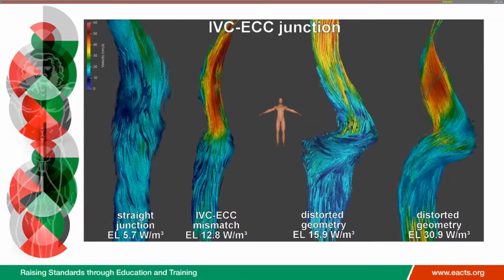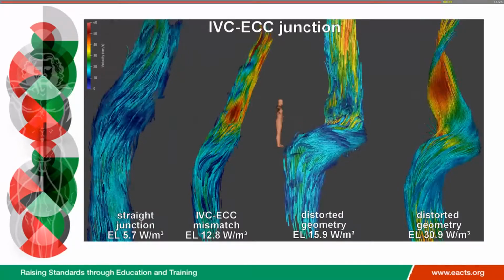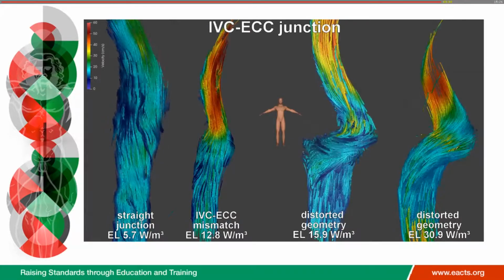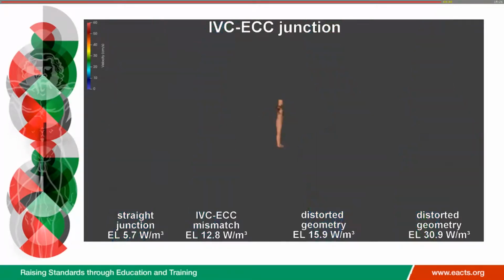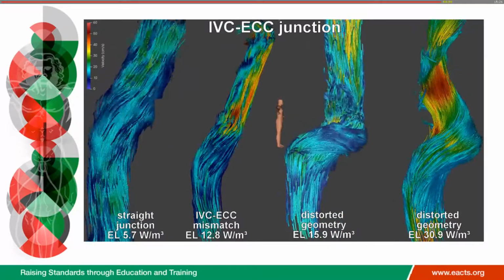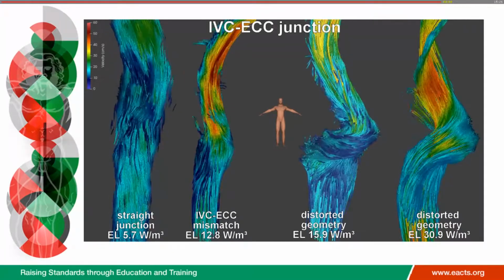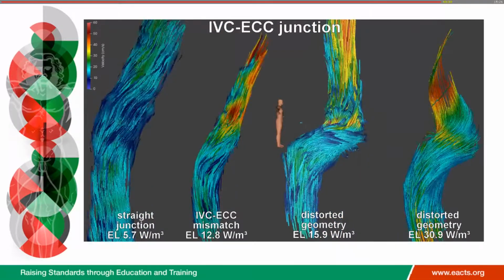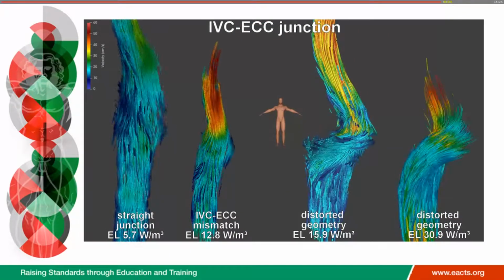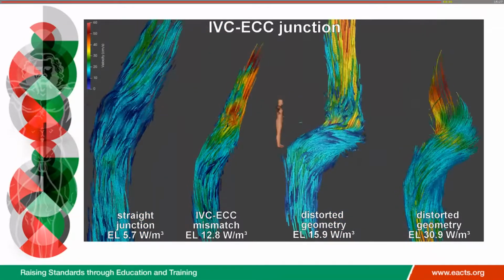Okay. But Christian, from your comment, does that mean you use the lateral tunnel? You think it's better dynamics? Because if you looked at the study by Francesco Migliacca from here and Marta Laval at Beauvais, they looked at the overall flow dynamics, computational flow dynamics, and if I recall correctly, they demonstrated that in terms of energy conservation and avoiding energy dissipation, the hemi-Fontan lateral tunnel actually had the best energy conservation. Do you have any data, could you study lateral tunnels? Yeah. So we're currently working on that.